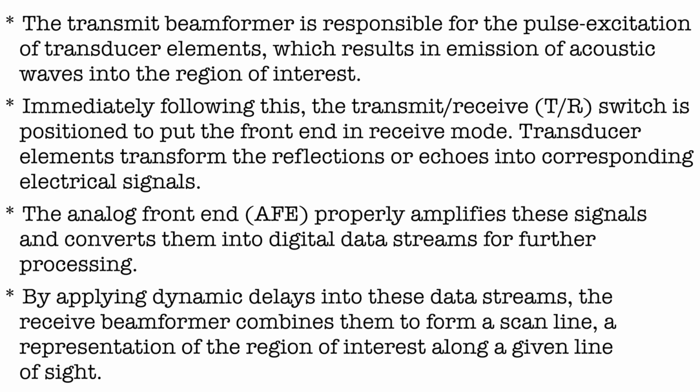Transducer elements transform the reflections or echoes into corresponding electrical signals. The analog front end, AFE, properly amplifies these signals and converts them into digital data streams for further processing.